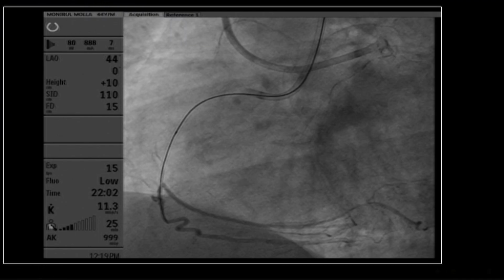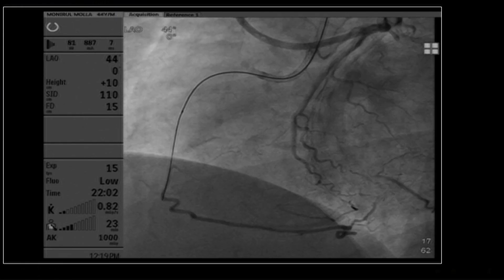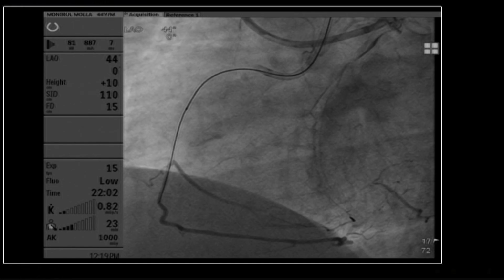Yes. Boom. You see, so that is the boom, huh? So now we'll do something. Okay, so now I'll talk a little. You see, in this crossing, now Pradhavis will not talk. Only you talk.